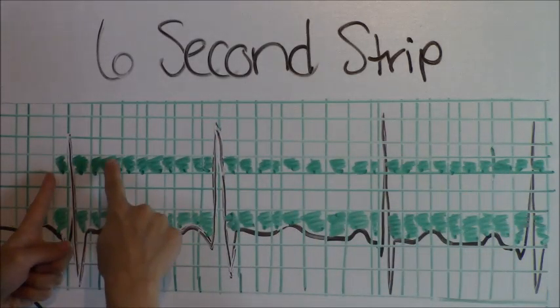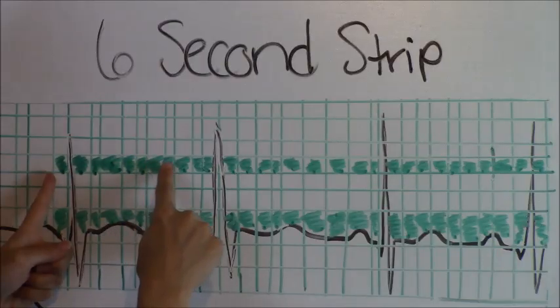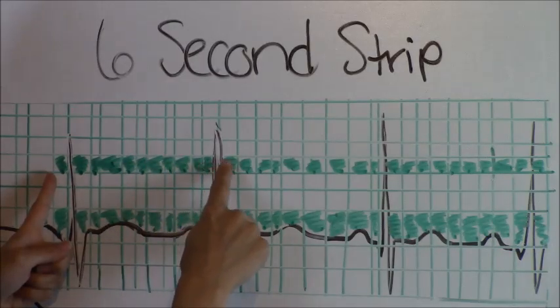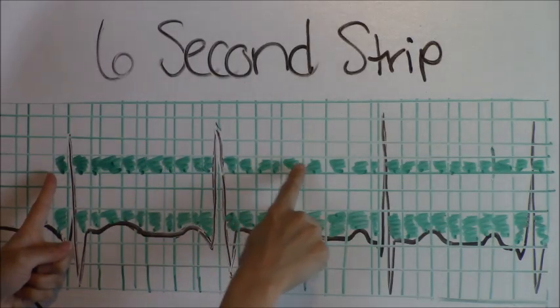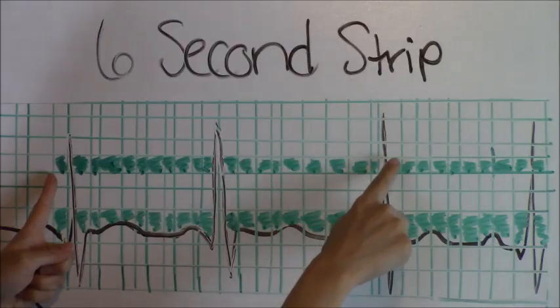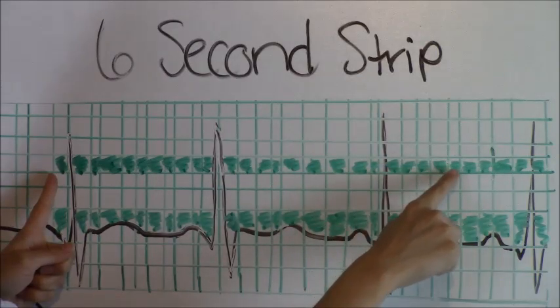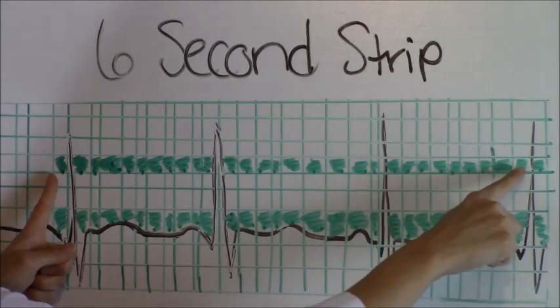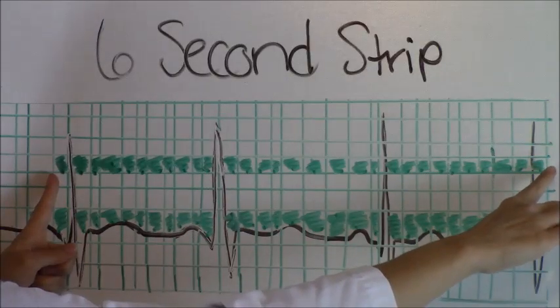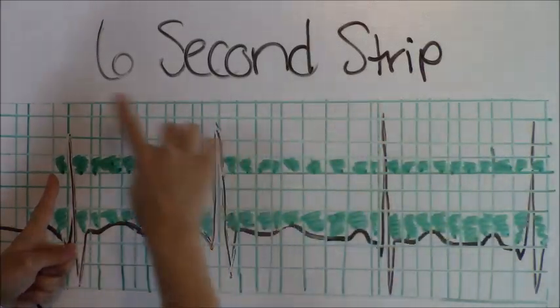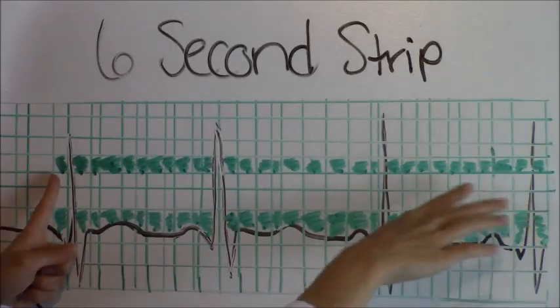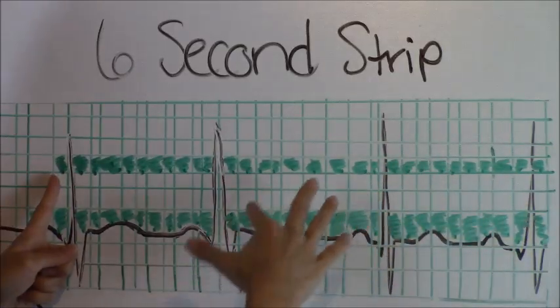1, 2, 3, 4, 5, 6, 7, 8, 9, 10, 11, 12, 13, 14, 15, 16, 17, 18, 19, 20, 21, 22, 23, 24, 25, 26, 27, 28, 29, 30. So let's count how many R waves presented. There was 1, 2, 3, 4. Four R waves.